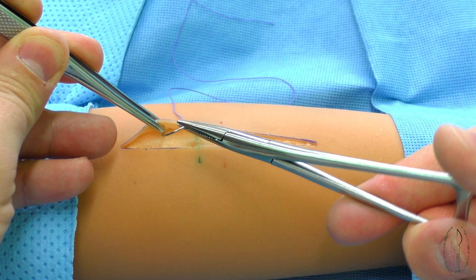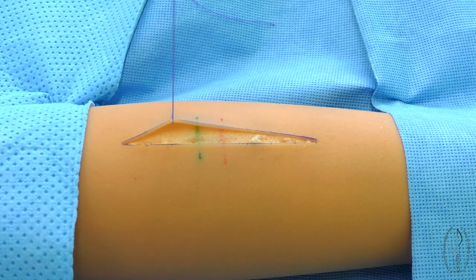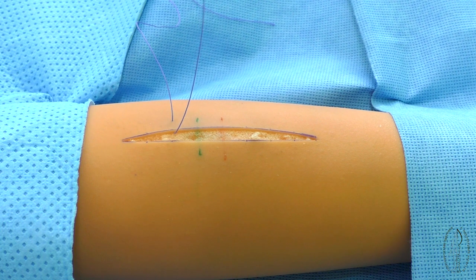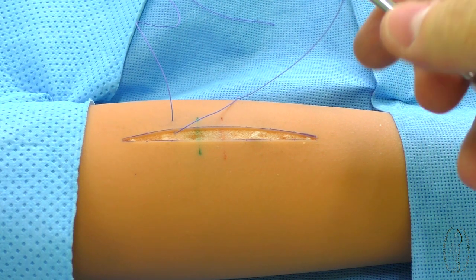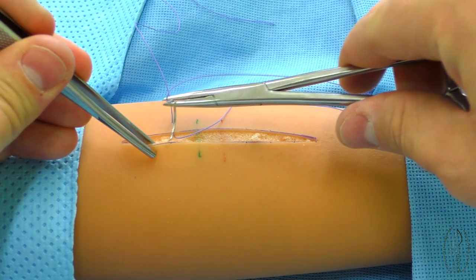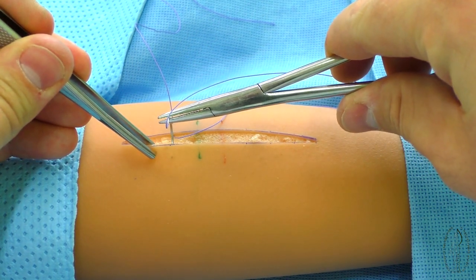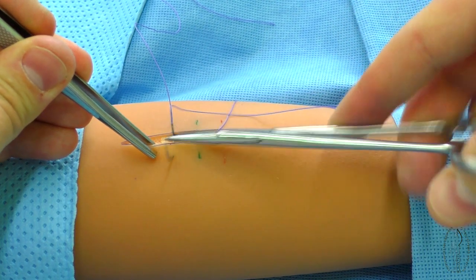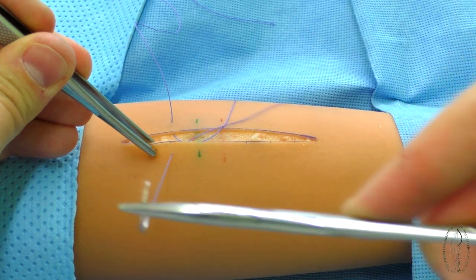The closest edge of the skin incision is fixed by the tweezers and turned toward oneself. The needle is inserted in a top-down direction. The needle tip is fixed by the tweezers above the skin surface. The needle holder is shifted along the needle and the needle is extracted.